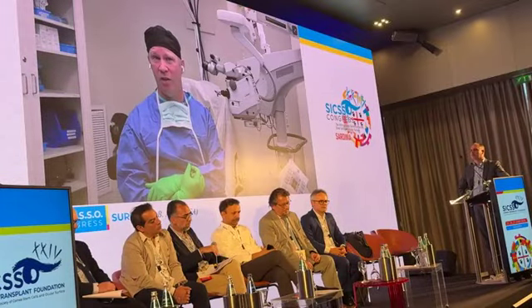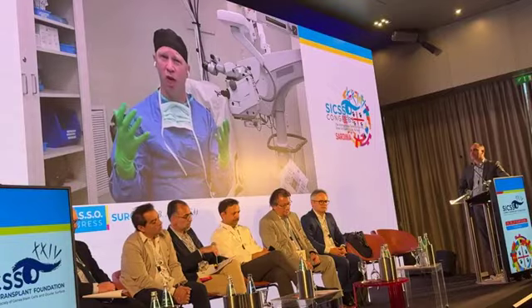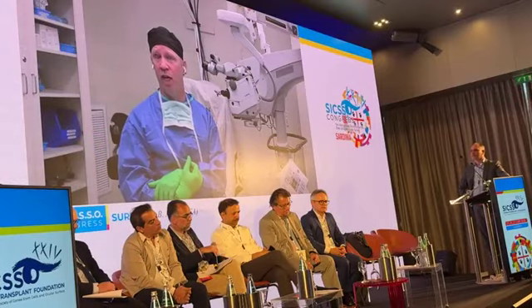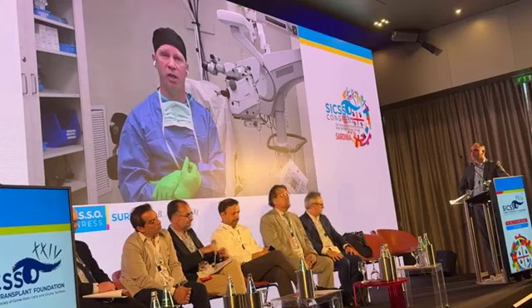I've been remarkably surprised at how relatively straightforward the docking has been. Now, you do applanate for these channels, and so I was worried about wrinkles in the cornea because these are conical corneas. They're not typical, but so far, we really haven't had much issue. We do a lot of verbal anesthesia, just making sure that we can center the treatment on either the pupil or the new treatment zone.